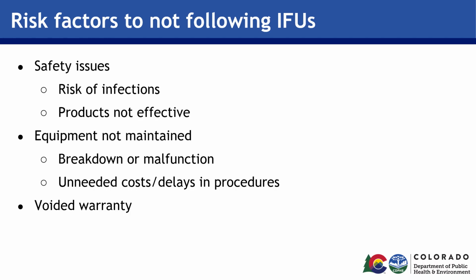The surface has now dried in seconds. The end result is that the pathogens are not killed and the device remains contaminated, creating a significant risk of transmitting infections to other vulnerable patients or residents.